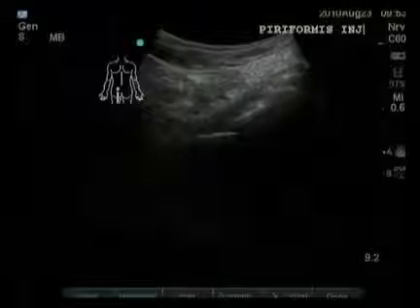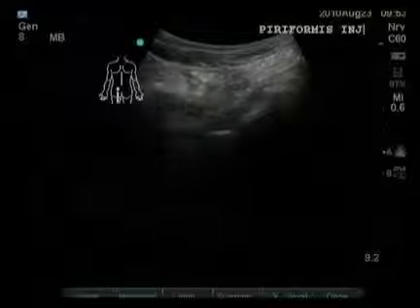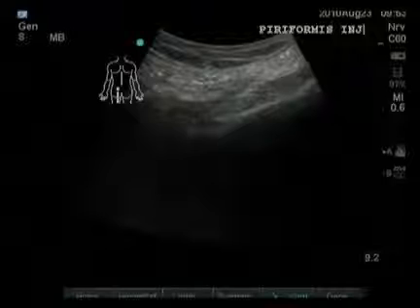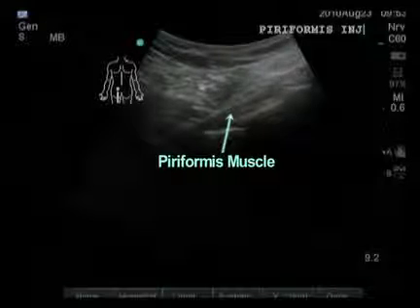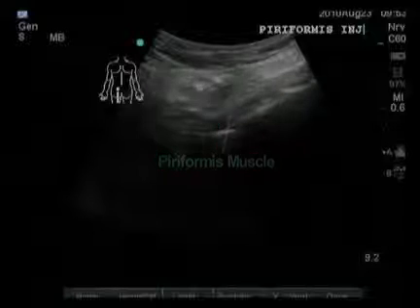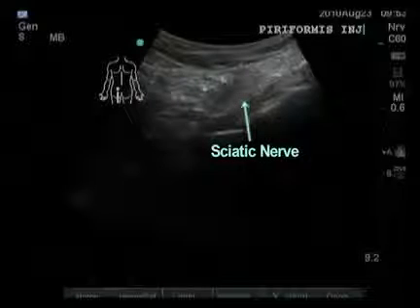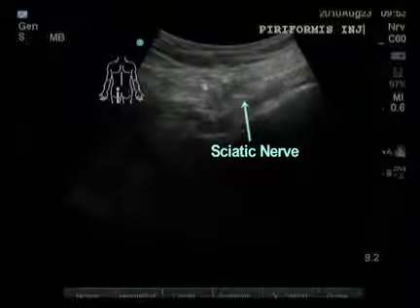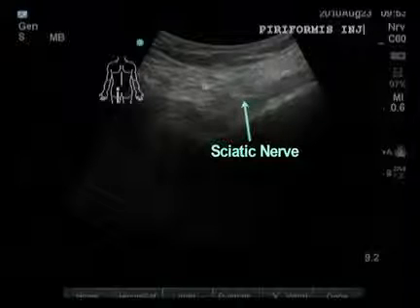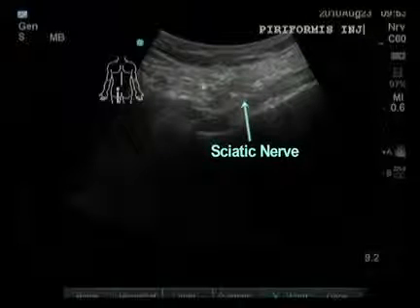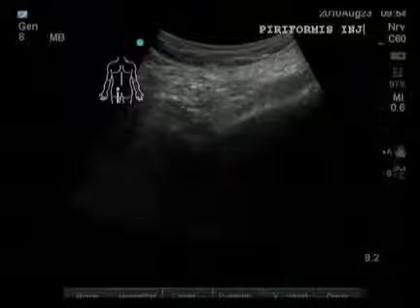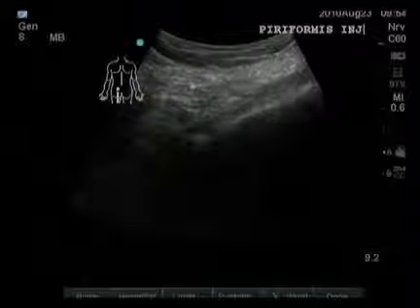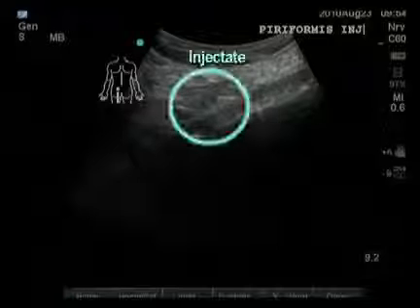This is the short axis view and the curvilinear probe is applied in the transverse orientation. The leg is being adducted and abducted to show the muscle moving. The sciatic nerve is clearly visible in the substance of the muscle — it is the band-like hyperechoic structure. The injectate is the hypoechoic structure that grows within the substance of the muscle.